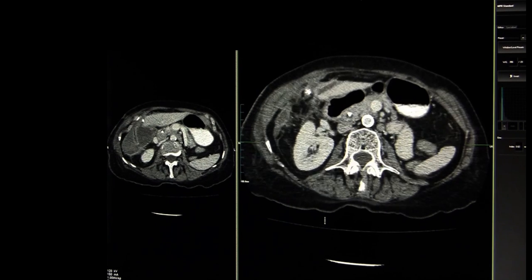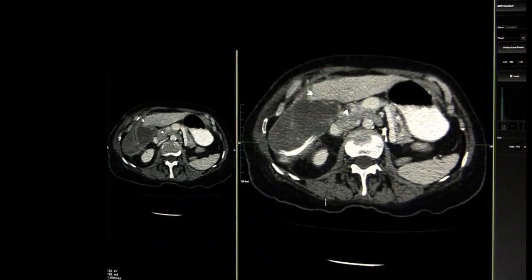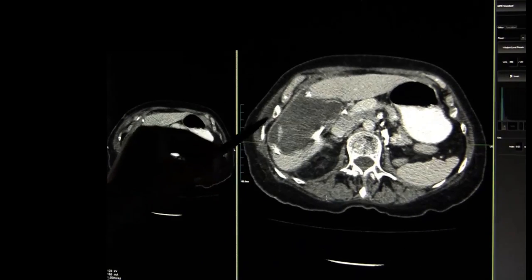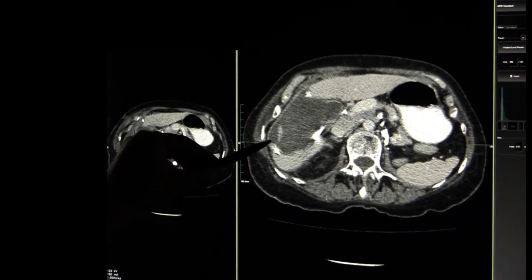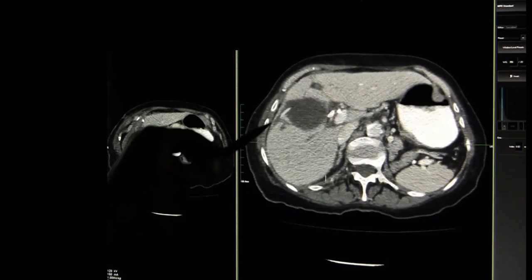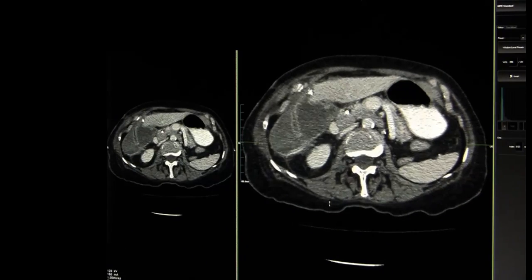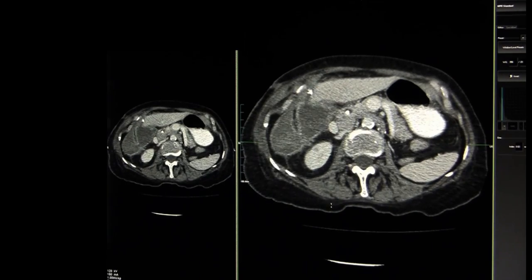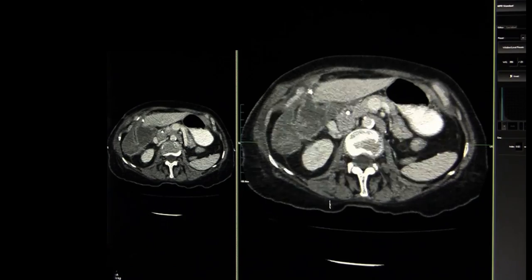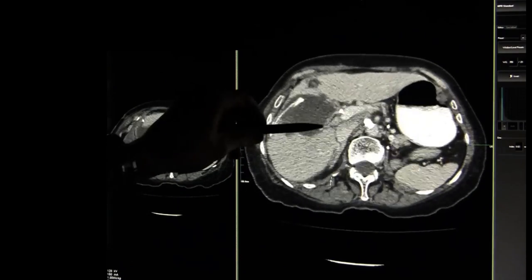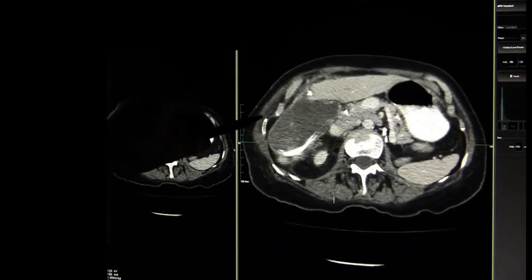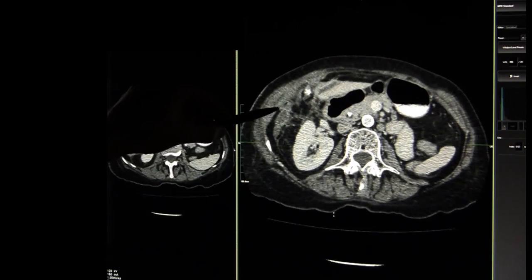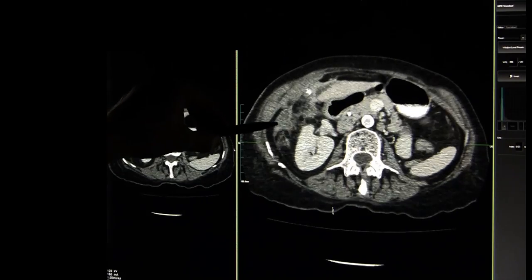What we're doing today is just a very straightforward CT-guided drainage. As you can see, there's a big collection here in the right upper quadrant. This is a complication post partial cholecystectomy for a necrotic gallbladder. There is a surgical drain but it doesn't seem to be working, so the surgeons have asked the patient to be sent down to us for a percutaneous drain.